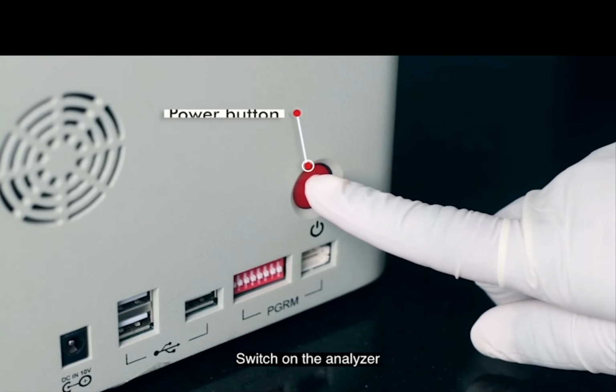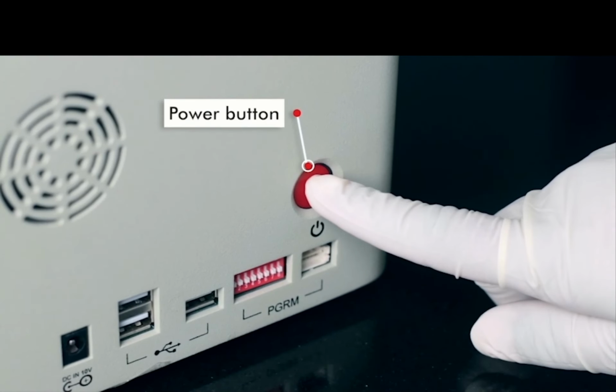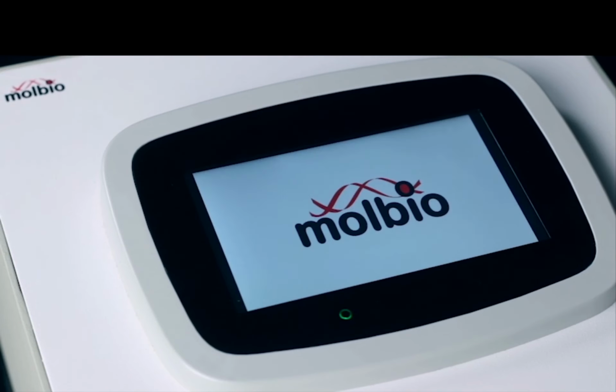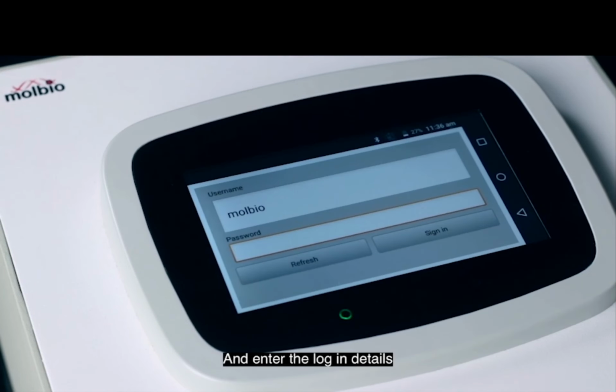So first switch on the machine by power button. So this is like your Android phone. It takes some time to boot up, so kindly wait. So here you can see this green color light which is down. If it is low battery, it will show blue color. You won't be able to do the test. You have to charge the machine. So enter your password.